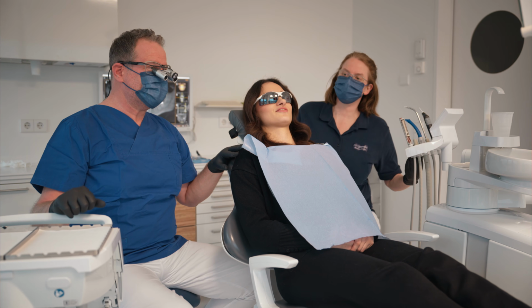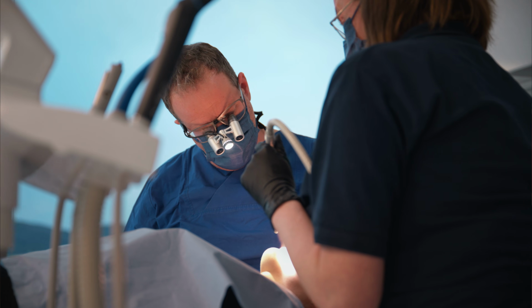The first step is to see your patient for an initial consultation. In our clinic, we'll allow an hour and 15 minutes for this. Now you're probably wondering, what is taking us so long? Well, in our experience, making the time available for the initial consultation is a highly trust-building moment. Of course, we do spend time looking in our patient's mouth, including a detailed dental inspection and vitality testing. We're checking occlusal contacts with the Shimstock foil, and we perform a 6-point perio charting and an assessment of the temporomandibular joints. Standard X-rays include an OPG and 4 single-tooth radiographs in the posterior areas of all 4 quadrants. And for any further diagnostics in terms of endo, perio and obviously implants, we take a CBCT.